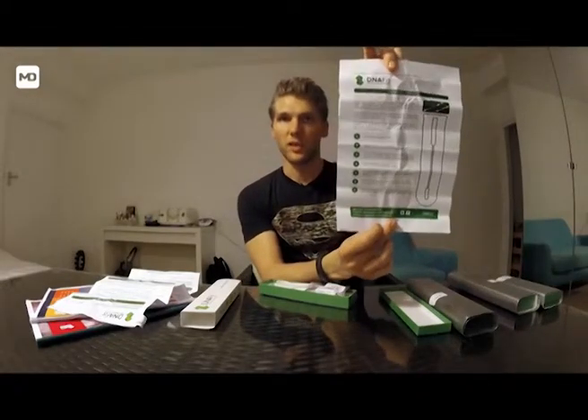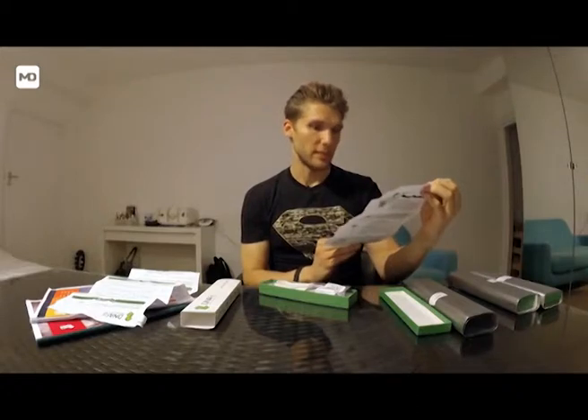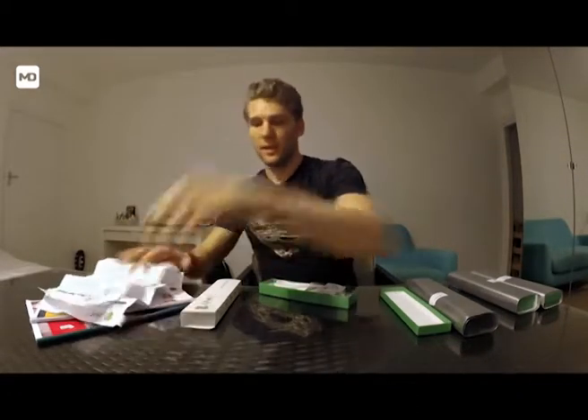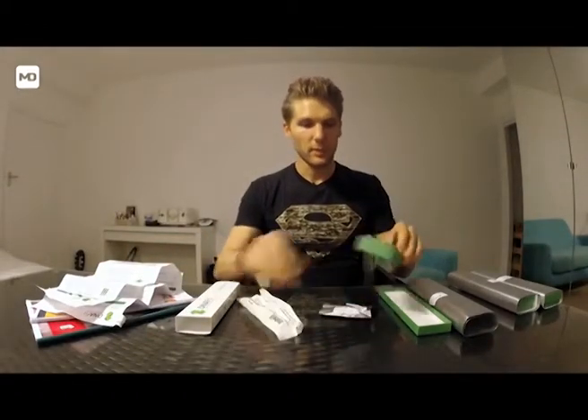Then you've got a little swabbing process guide which tells you exactly what you should be doing and how to do it, so it's pretty easy and really straightforward. Now let's have a look at the actual mouth swab.